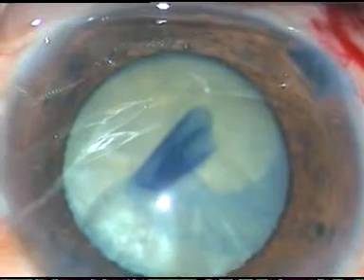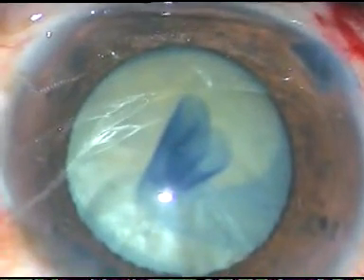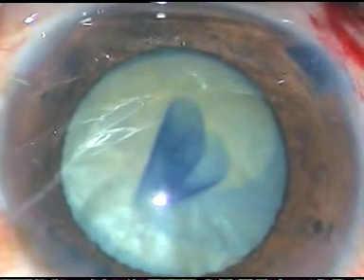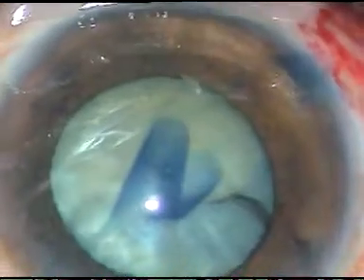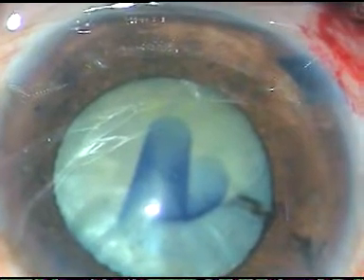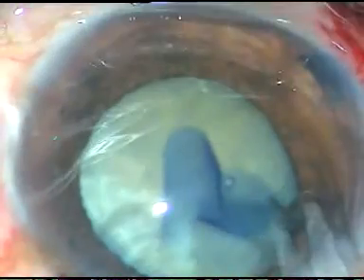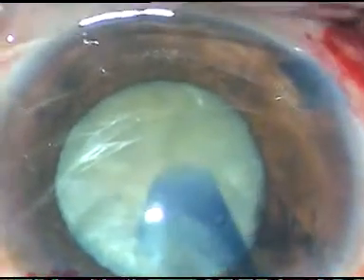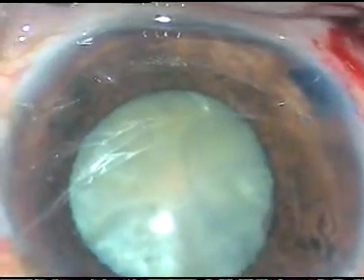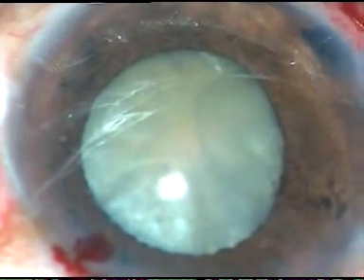Viscoelastic substance is injected. I have asked for an instrument to retract the iris. Here I could see, though it is not in this field, that it has gone too peripherally and it is not possible to retrieve it. So I ask for scissors and I cut the rhexis, cutting the capsule like this. Should I convert to ECCE or should I attempt phacoemulsification? Since I do direct phaco, I usually attempt phacoemulsification in such cases.